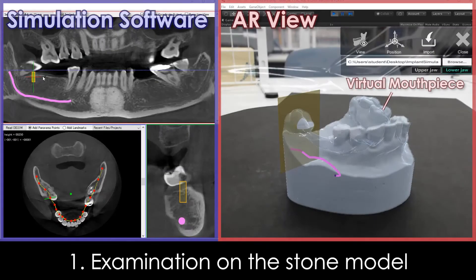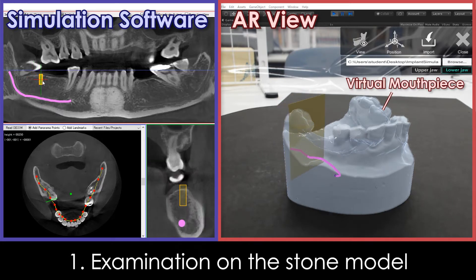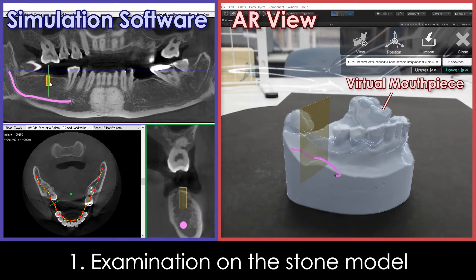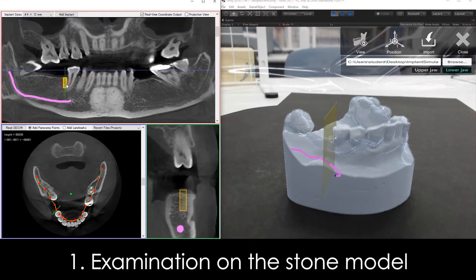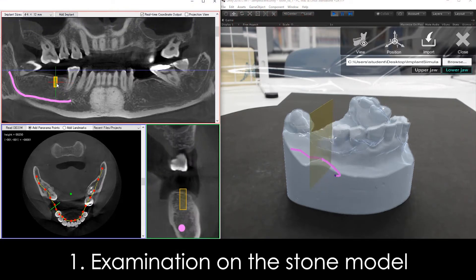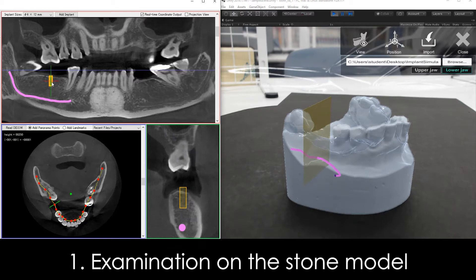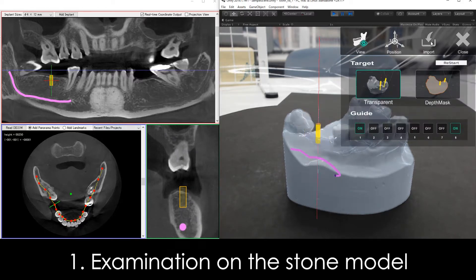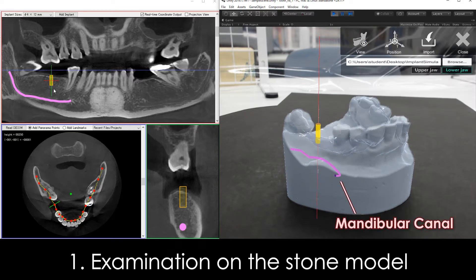In the case of another patient, implants are moved on the simulation software screen to find the implant placement positions. The mandibular canal can also be displayed in the stone model for this patient.